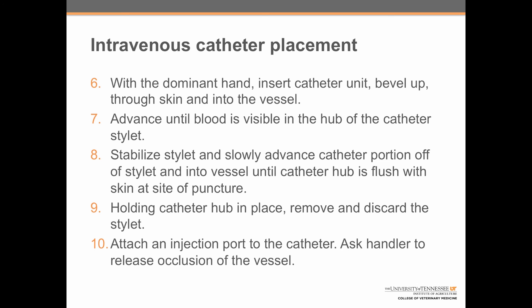Advance the catheter unit until blood is visible in the hub of the catheter stylet. As soon as that happens, stabilize the stylet and slowly advance the catheter portion off and into the vessel until the catheter hub is flush with the skin at the site of puncture. Holding the catheter hub in place with one finger of the non-dominant hand, remove and discard the stylet. Step 10: attach an injection port to the catheter to seal the opening and prevent blood from escaping, and at the same time ask the handler to release occlusion of the vessel.